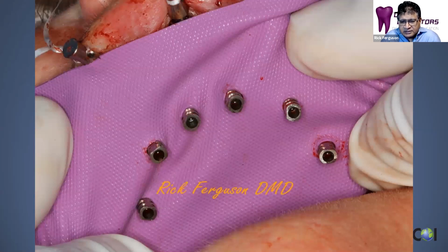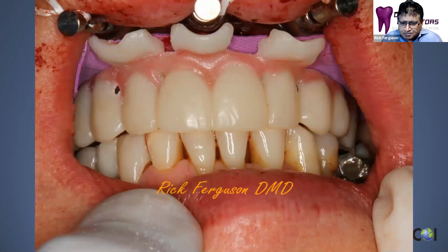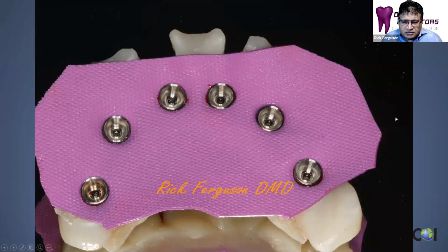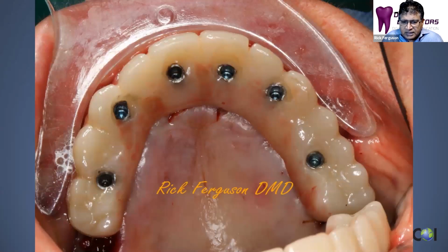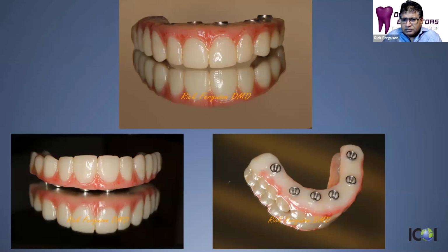So we will take the denture and try it in first. Of course, with some of the copings, typically you have to reduce the height. We'll put some rubber dam over that, and then we will do a pickup in the mouth by injecting material through these pickup holes. And in this case, this is what it looks like after the material set. We've picked up the copings by unscrewing them. Now we can take the whole thing out and hand that over to my assistant, who will finish by filling in any voids, finish the characterization, and have that fully cured so that we can put that back in the mouth. And this is what it looks like going back in, attaching to the implant. So while she is doing that, I will be removing the bone reduction guide and doing the suturing.